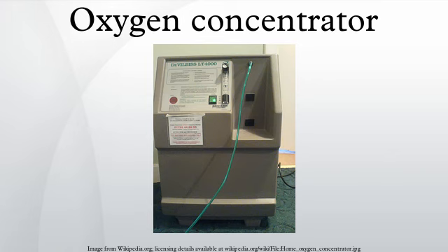Oxygen concentrators are considered sufficiently foolproof to be supplied to individual patients as a prescription item for use in their homes. Typically they are used as an adjunct to CPAP treatment of severe sleep apnea. There also are other medical uses for oxygen concentrators, including emphysema and other respiratory diseases.